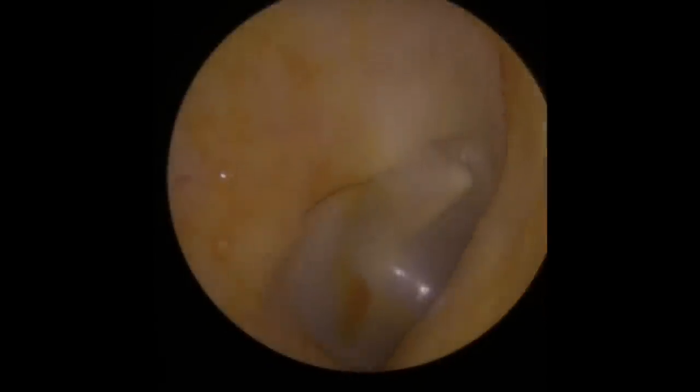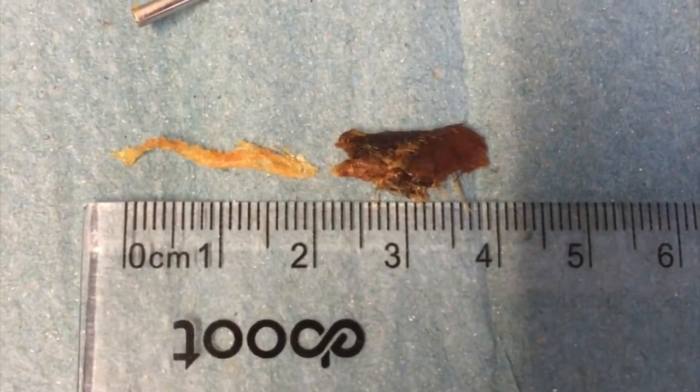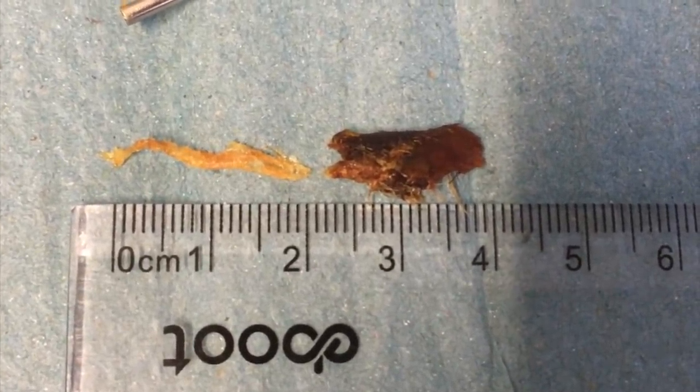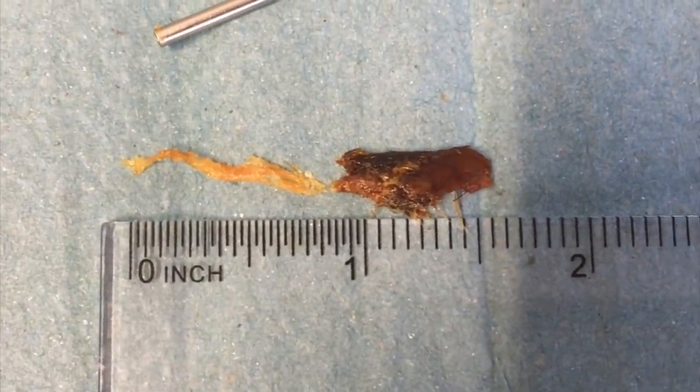And you can see these little bits breaking off. It's got wedged in the outer part of the ear canal there. Just a little bit too big to fit out. There we go. And when we take a look in there, there's the eardrum itself. A little bit of oil there you can see on the drum. So that long strip of skin you can see there was the first piece we removed, and then you have the large chunk of wax that was sitting behind it.